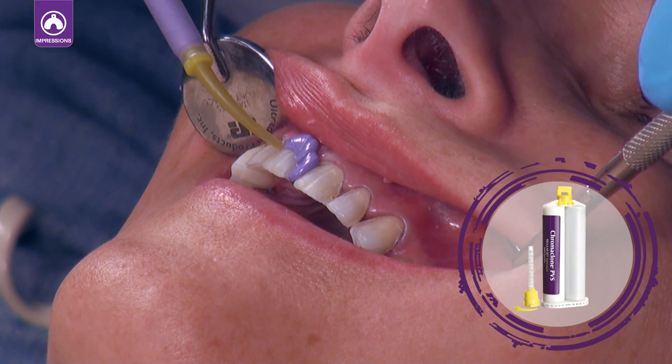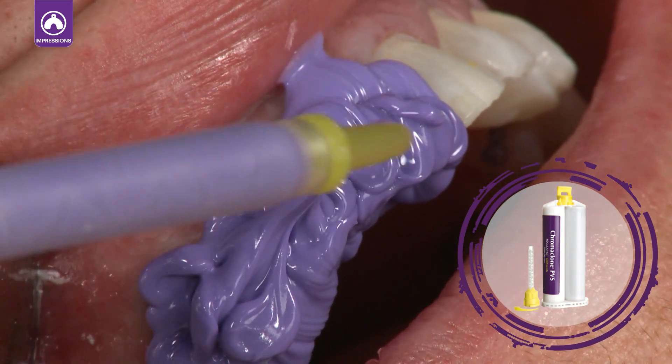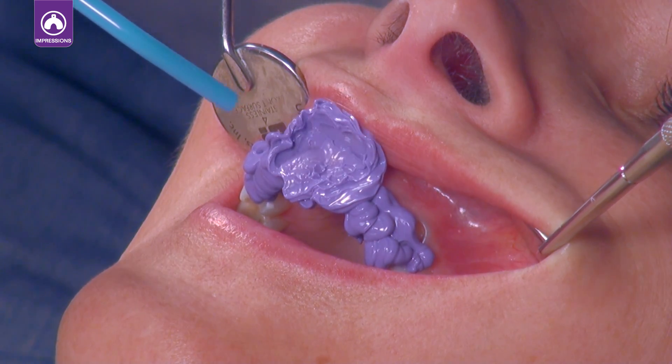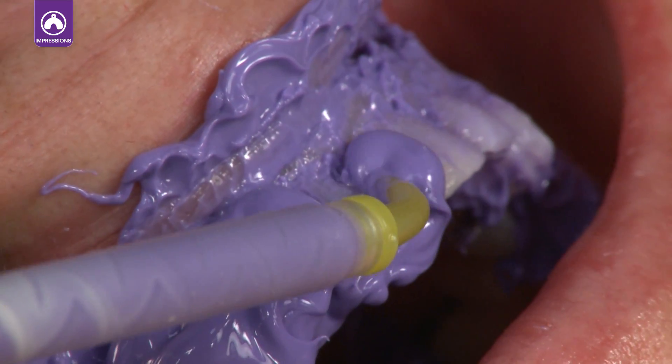Inject Chromaclone PVS light or super light body material directly onto the teeth. The light body flows easily and sets after just a few minutes. Air thin the material on the teeth to get full coverage and eliminate voids. Then apply a second layer of Chromaclone PVS light body.